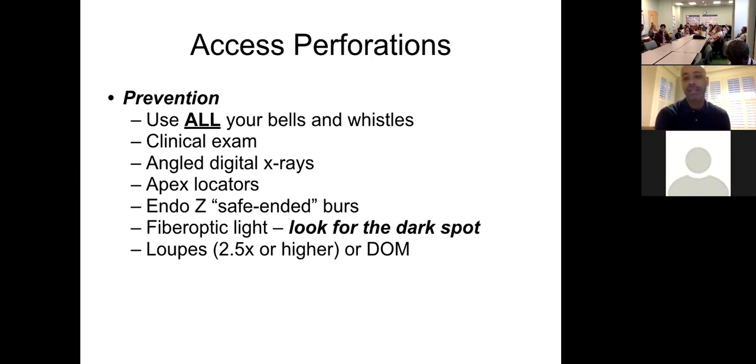the fiber optic light. Always have a light on your loops whenever you're doing endo. I don't want to see any of you doing endo without loops and the light. It's just not a good idea. You're setting yourself up for a bad situation.